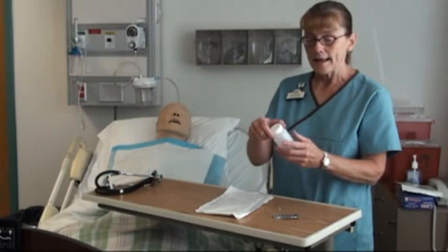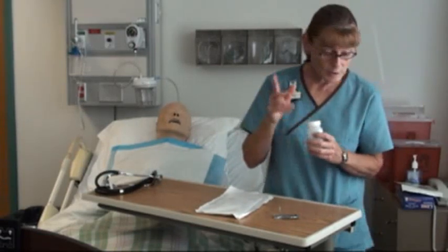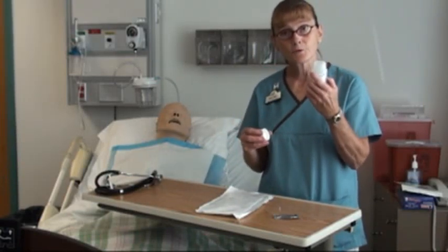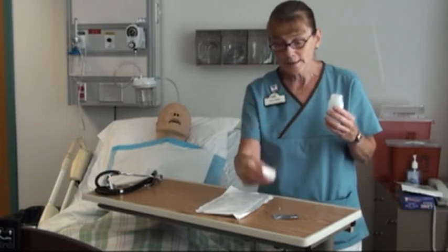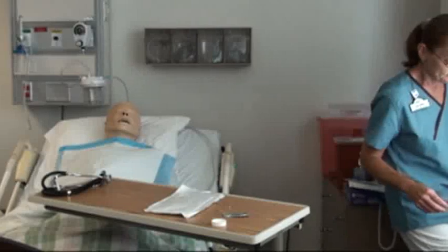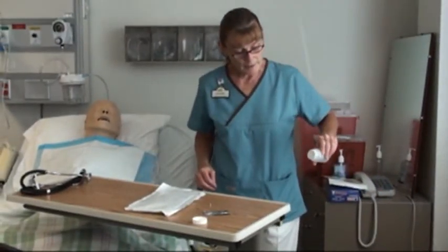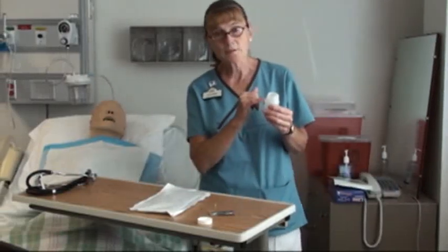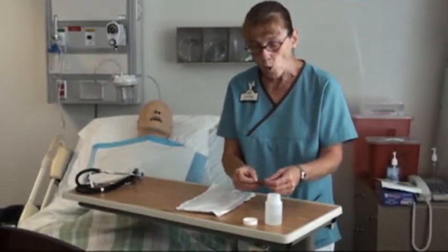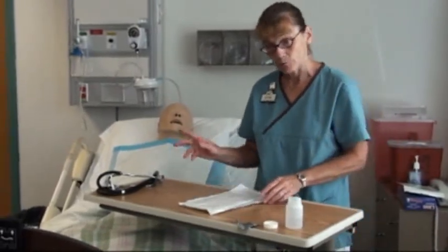We have our saline here. If it's a new bottle, you can open it up and you do not have to lip it. But we're going to say this bottle has been open but less than 30 days, so I'm going to use it. My lid's upside down. I'm going to lip my saline like syrup or honey — it pushes the organisms off the outer edge. Open up your water-soluble lubricant that we might need — it's water, not oil.